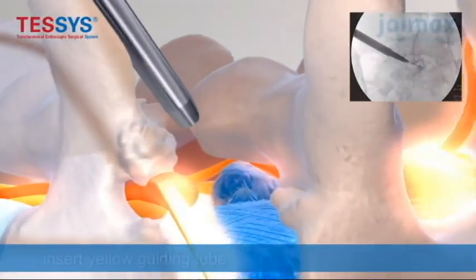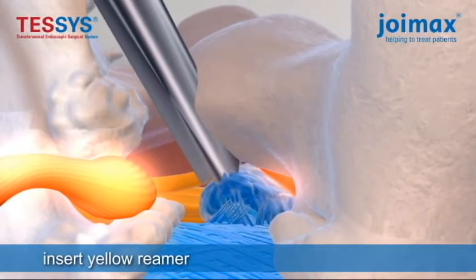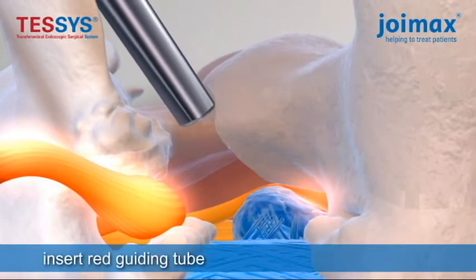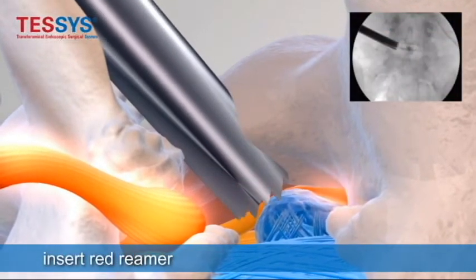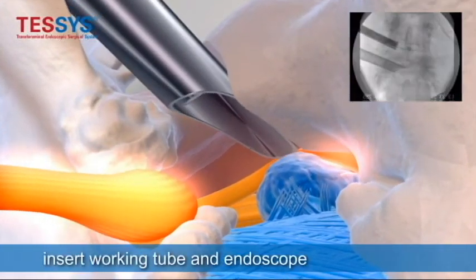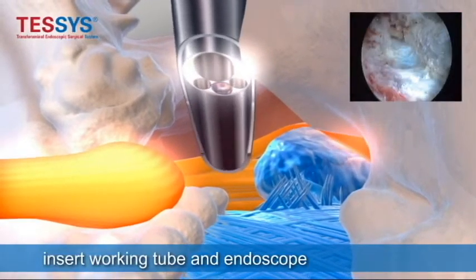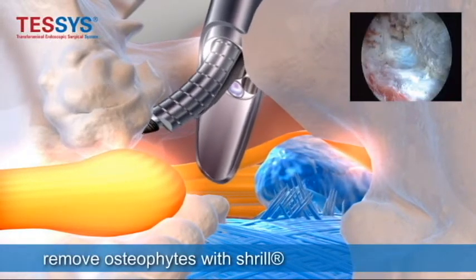The part in blue, which is a protrusion of the disc — after reaming it, it makes it easier to get access to the herniation and it also forms a foraminotomy to open up the neuroforamina for more space for the nerve root. You can also put through the working channel — you can see right there — a burr, which is a drill that takes down the bone spurs, relieving the exiting nerve root to expand.